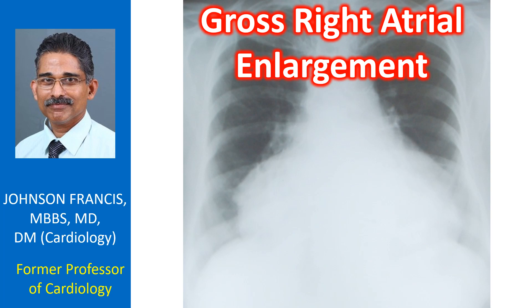X-ray shows gross enlargement of the cardiac silhouette. The right heart border extends far to the right, indicating gross right atrial enlargement. Presence of an associated pericardial effusion cannot be ruled out.